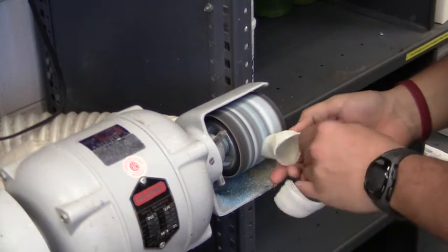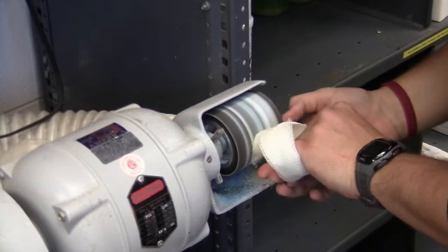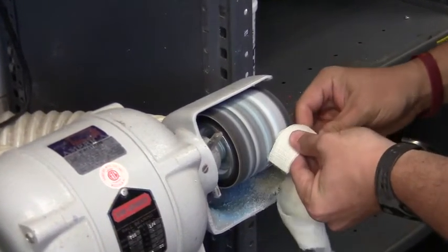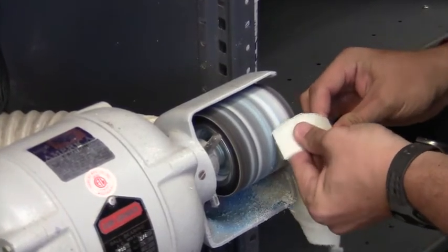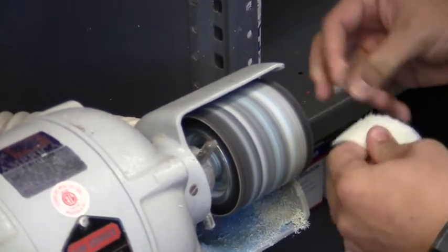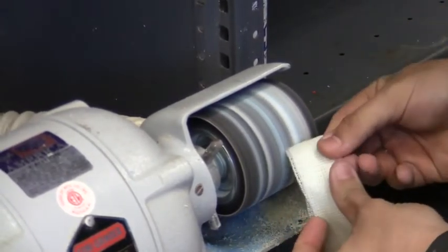Using a stationary grinder or other sanding tool, sand down the edges of the cast in order to make them smooth. Be sure to round the end of the cast that will wrap around the athlete's hand. You'll also need to smooth down the thumb portion of the cast to allow for full flexion and extension of the athlete's IP joint.